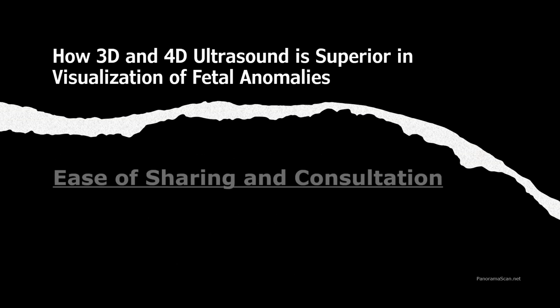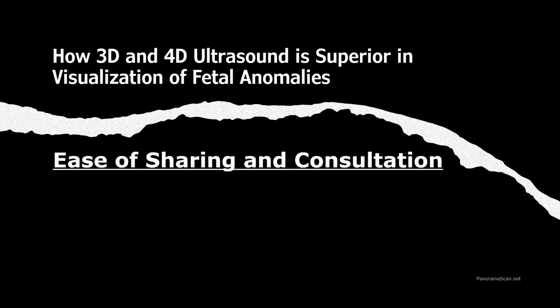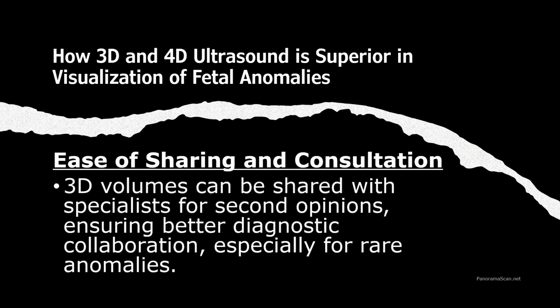One of the key advantages of 3D and 4D ultrasound is the ease of sharing and consultation. The digital nature of 3D volumes allows for seamless transfer of data between healthcare providers, making it easier to collaborate on difficult or rare cases. 3D volumes can be shared electronically with specialists across different medical centers or disciplines, ensuring that multiple expert opinions can be gathered without the need for the patient to undergo repeated imaging.